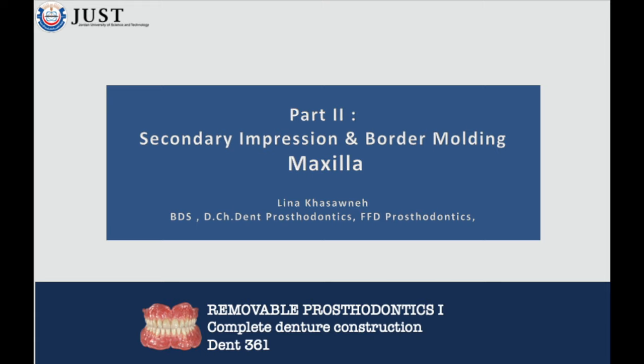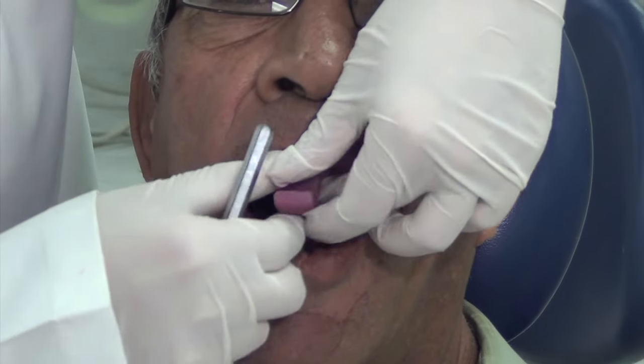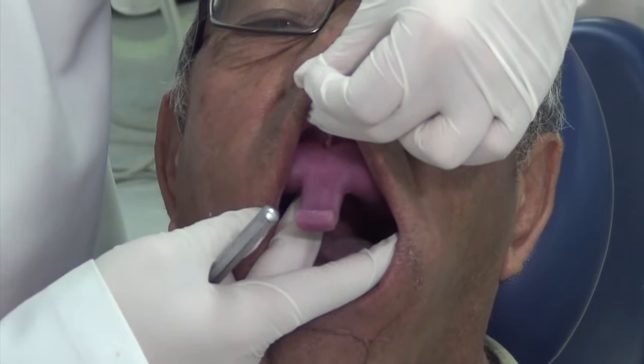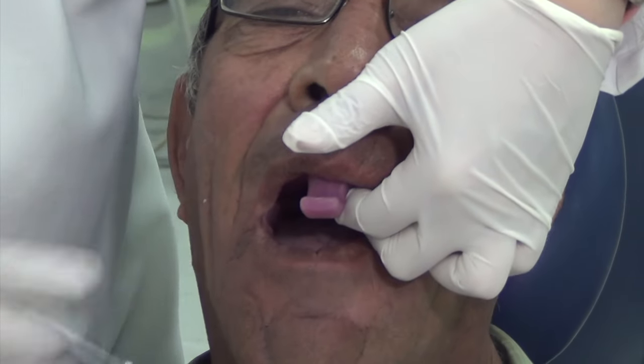This video will demonstrate the impression making procedures for the edentulous maxilla. The border of the tray is marked two to three millimeters short of the intended border. Generous relief should be made to the frena, and the border should extend posteriorly to the vibrating line and the hamular notch area.